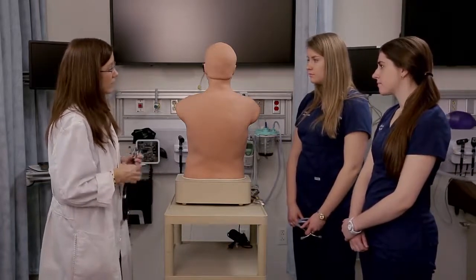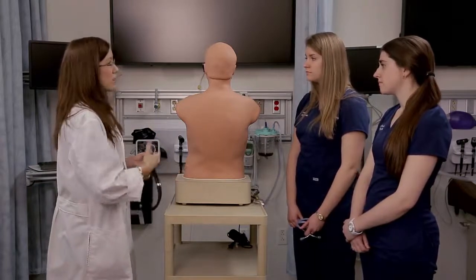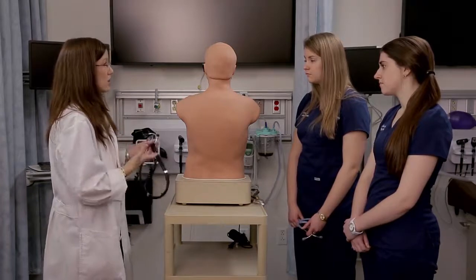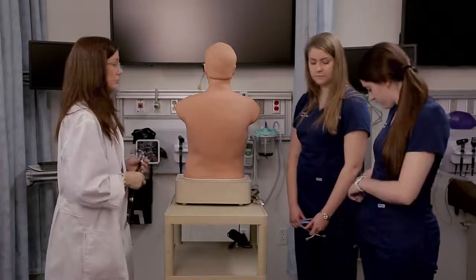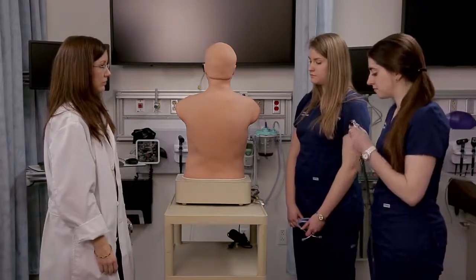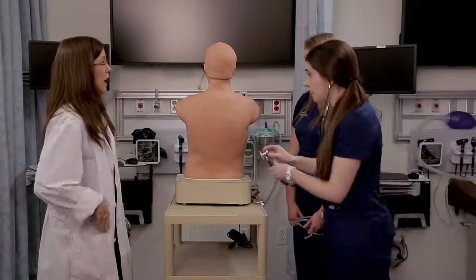Again, if your provider were listening and they thought they heard one of these sounds, they would do a very thorough assessment to listen. And we can actually demonstrate some of those sounds now. So do you want to listen? Sure. First, we'll listen to crackles.